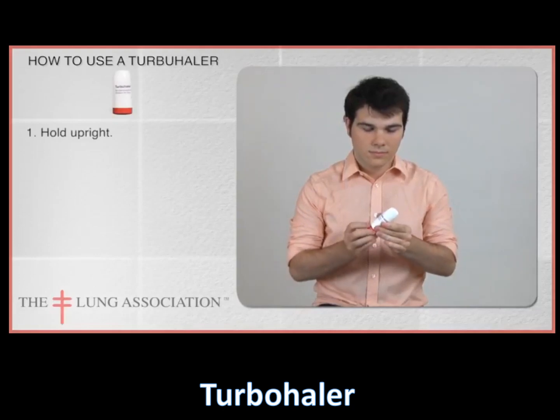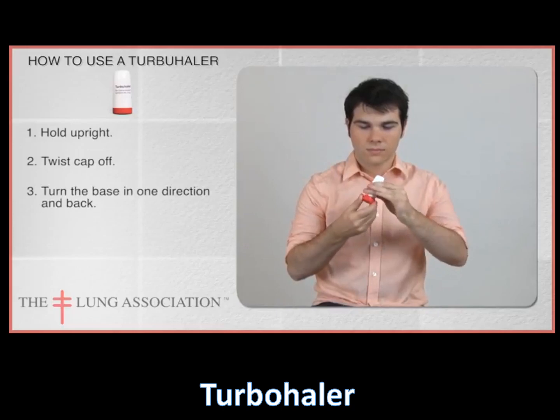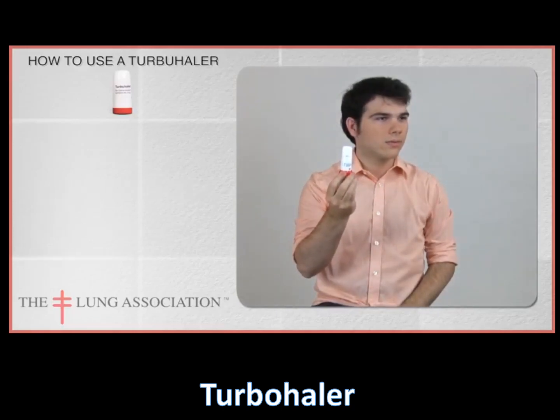Hold the inhaler upright and twist the cap off. Turn the base in one direction and back until you hear a click. Breathe out, away from the turbuhaler.